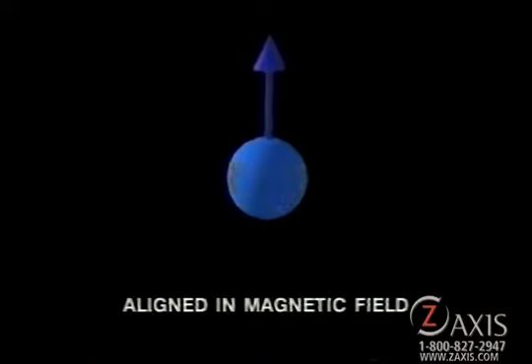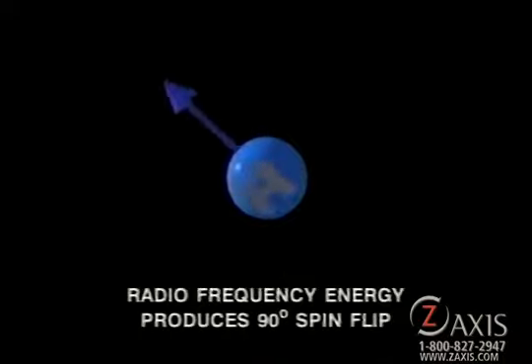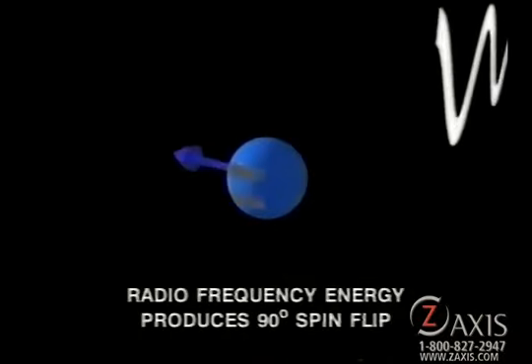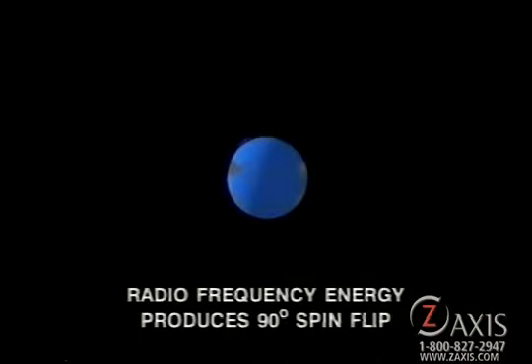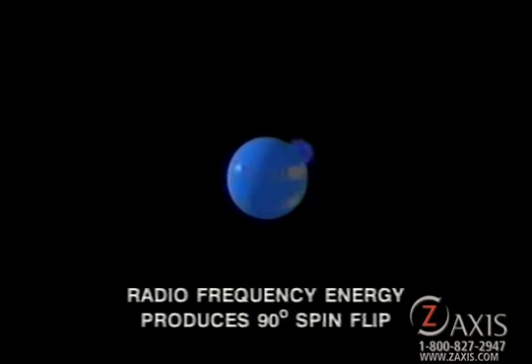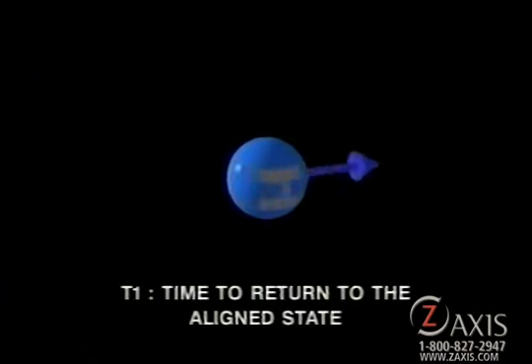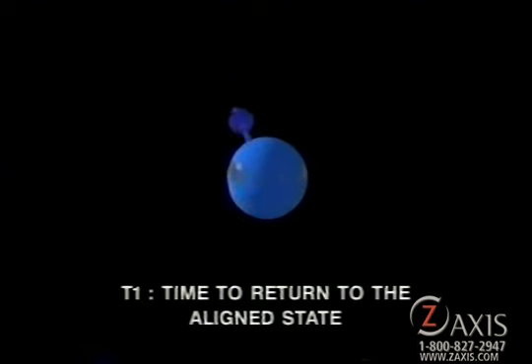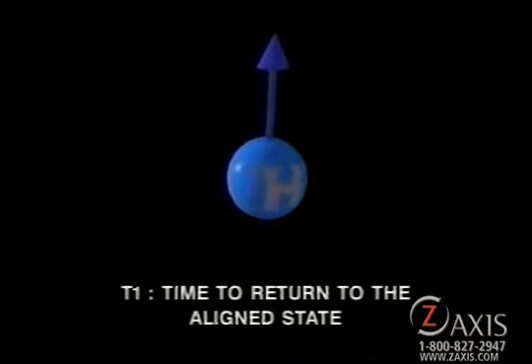Exposing these aligned and spinning protons to a pulse of radiofrequency or RF energy causes them to spin 90 degrees away from the original axis in a process called spin-flipping. The T1 time is simply the time that it takes for the proton to return to alignment with the external magnetic field. It turns out that the T1 time is dependent on the type and condition of the tissue that contains the protons.